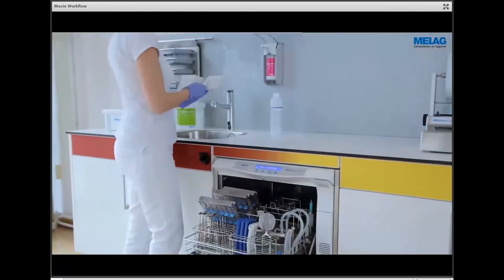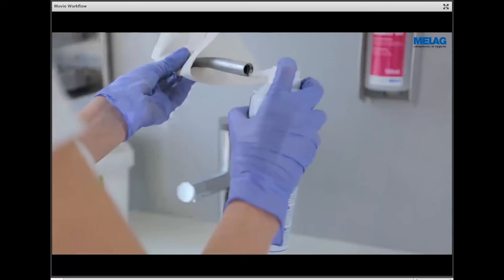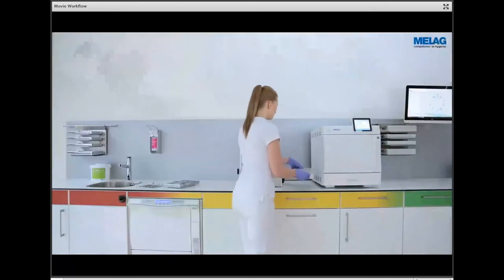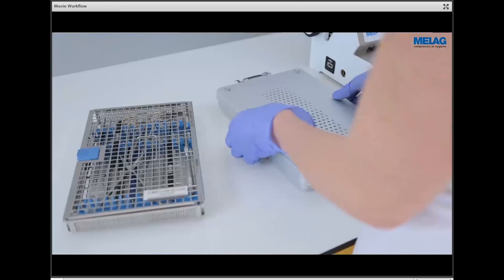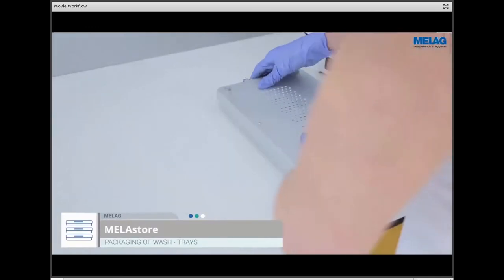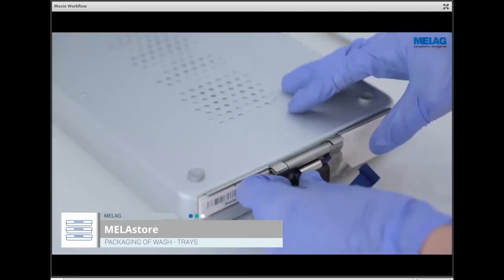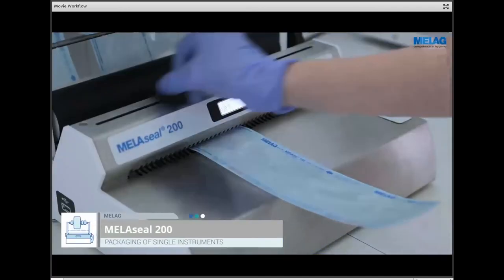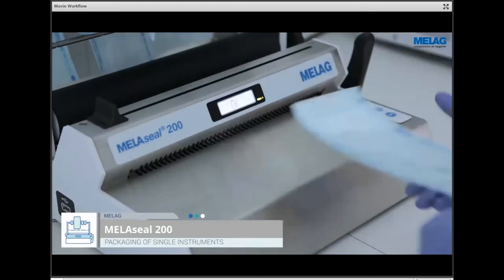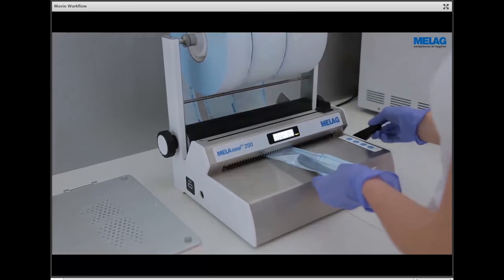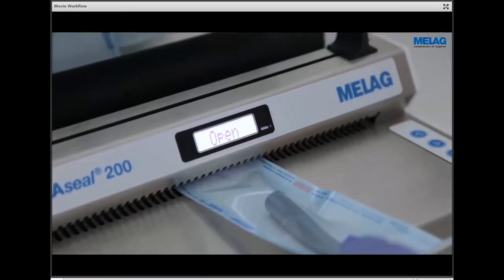Handpieces and turbines require specialist care and lubrication in compliance with manufacturer specifications. Surgical instruments must be wrapped for sterilization. The use of Melastor trays and Melastor boxes optimizes workflows, leading to considerable improvements in working safety, reproducibility, and efficiency. Individual instruments are wrapped in Melafol. The validatable sealing device Melaseal 200 permits a standardized and reproducible process that can be documented.